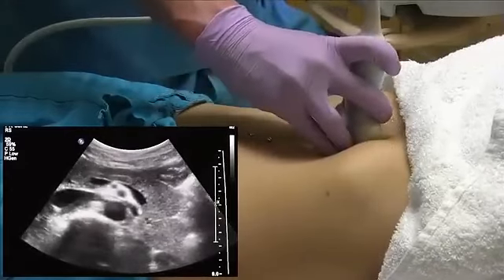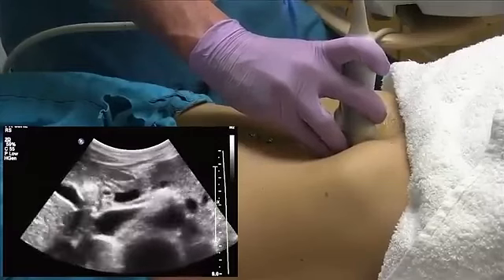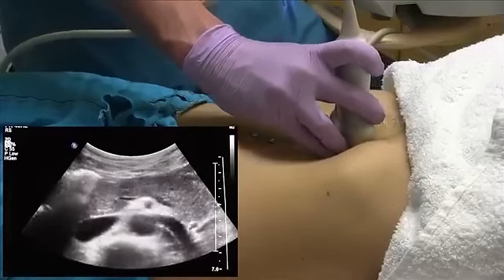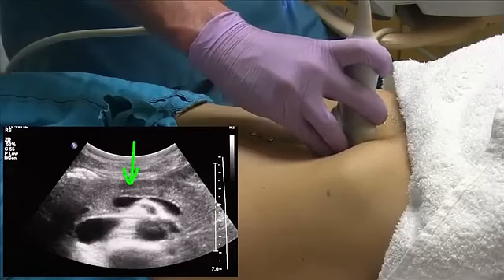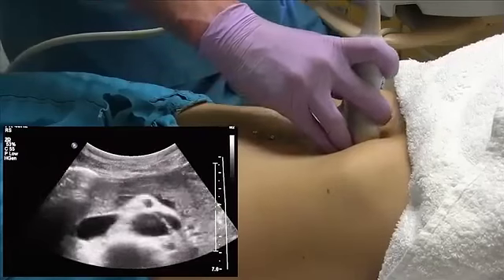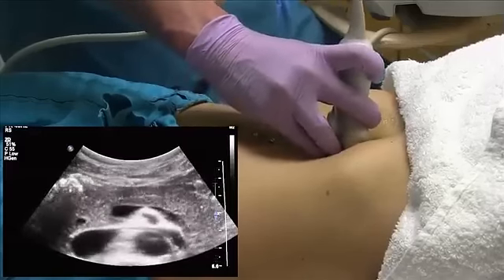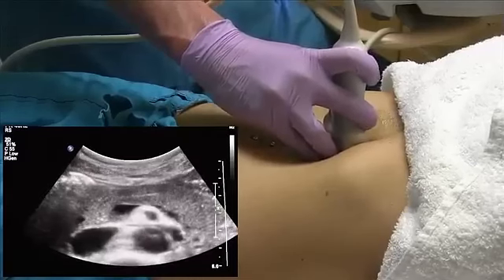When you're looking at the pancreas, you want to look for certain structures as well. One of the structures that we can look for is the pancreatic duct, which runs right through the body of the pancreas, throughout its entire length. In a lot of patients, you will be able to see the pancreatic duct, and we usually use 2 millimeters as a cutoff for our normal pancreatic duct measurement.